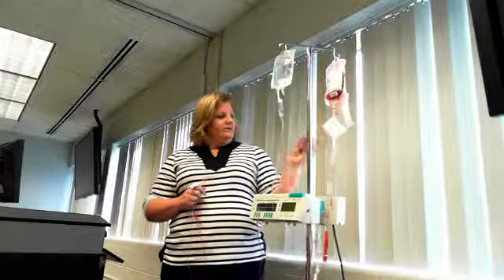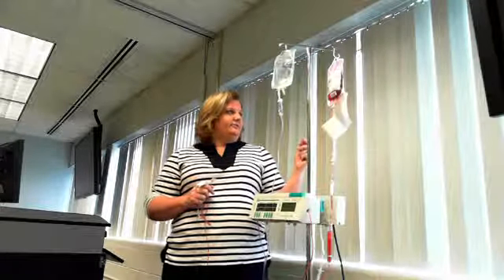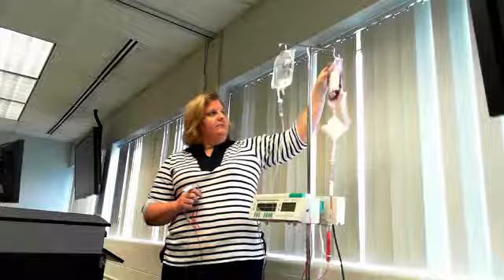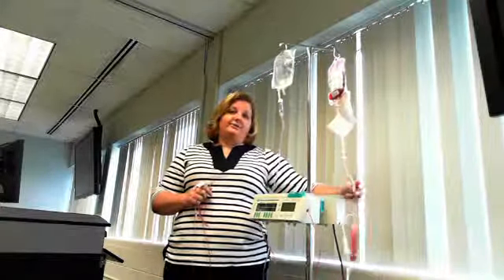Once the blood has been given, you take what's called a pigtail attached to the blood bag, pull that off, and send it down with your vital signs sheet to the lab so they can keep a record of what was given to the patient. The empty blood bag and tubing all need to be disposed of in a red biohazard bag. And that should be it.